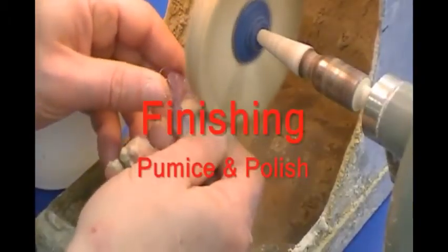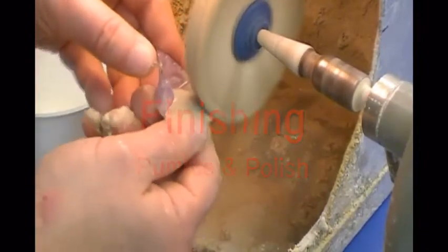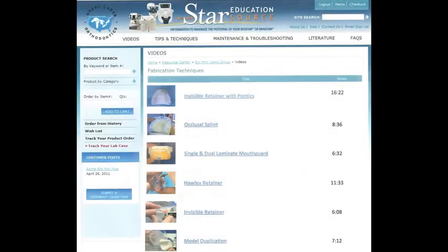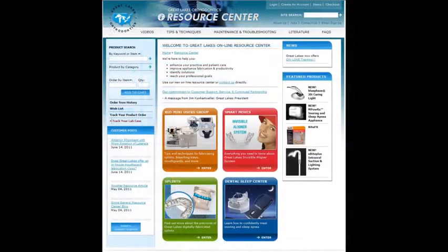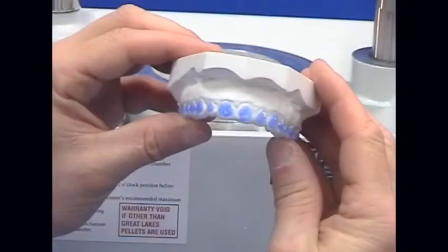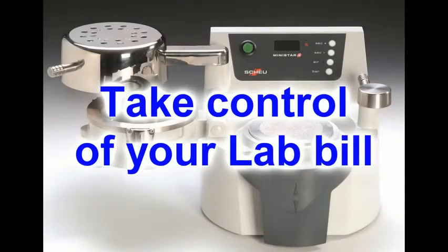This retainer is pumiced and polished using the same procedures outlined for the upper Hawley retainer. These technique videos, along with the other information on the Resource Center, can show you how to get the most from your machine and how to ultimately take control of your lab bill.